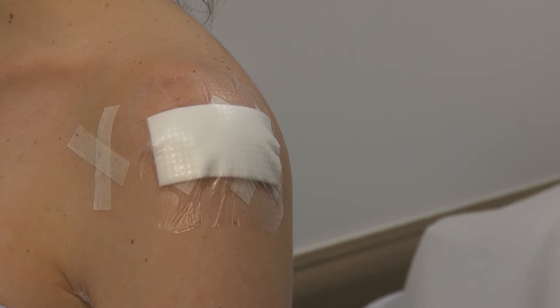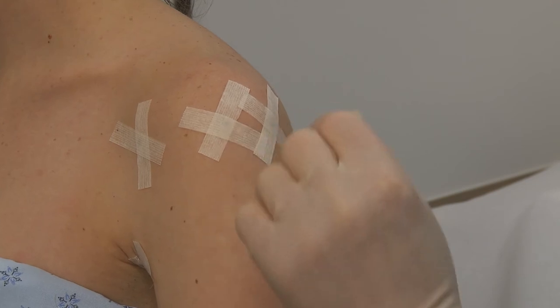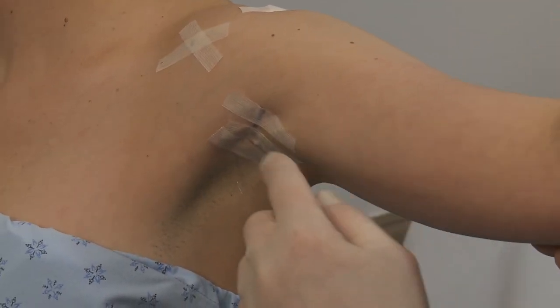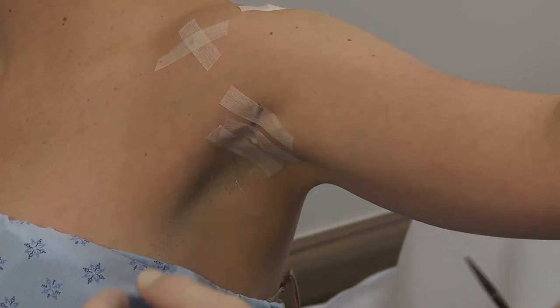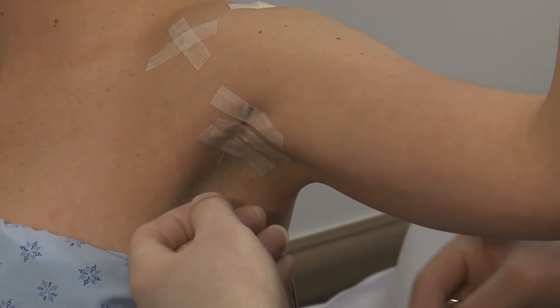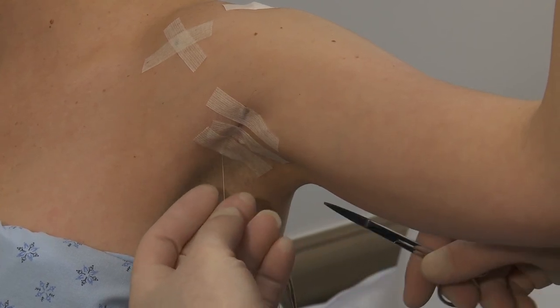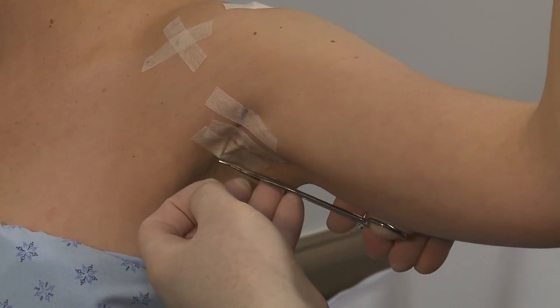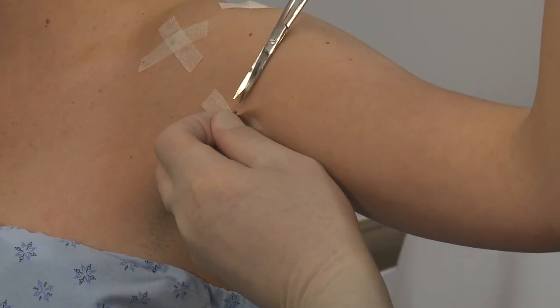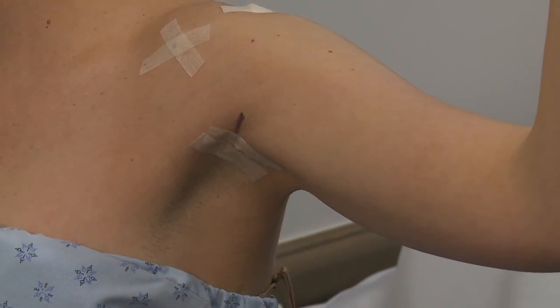At your two week post-op appointment, the SteriStrips over your portals should be removed. There are no sutures to be removed — they are absorbable. Your bicep tenodesis incision will also be closed with absorbable sutures. However, the ends will need to be trimmed. To do this, simply locate the ends of the suture. You may need to remove some SteriStrips to find these. The suture looks like clear fishing line material. To trim, simply pull the suture taut and cut at the level of the skin. This will be repeated at the other end of the incision. The SteriStrips can also be removed at this time.